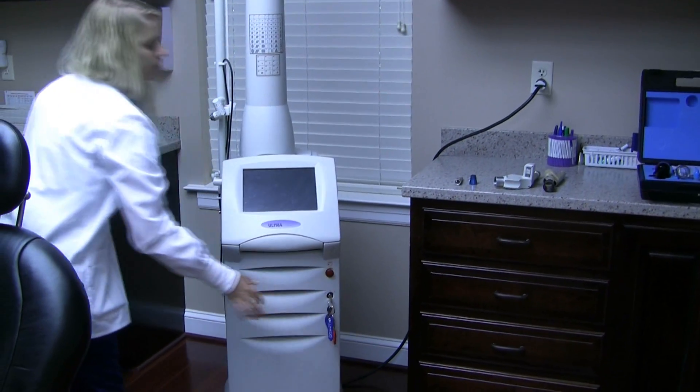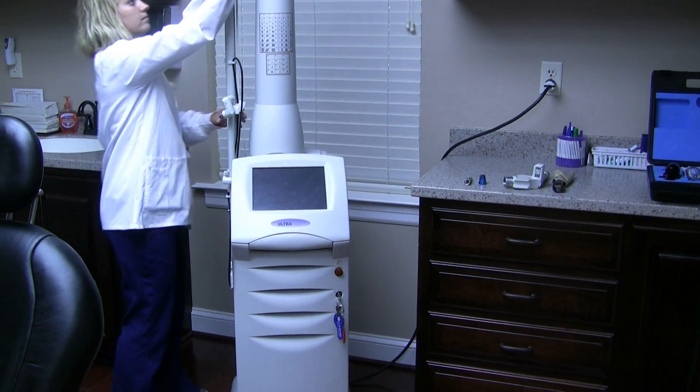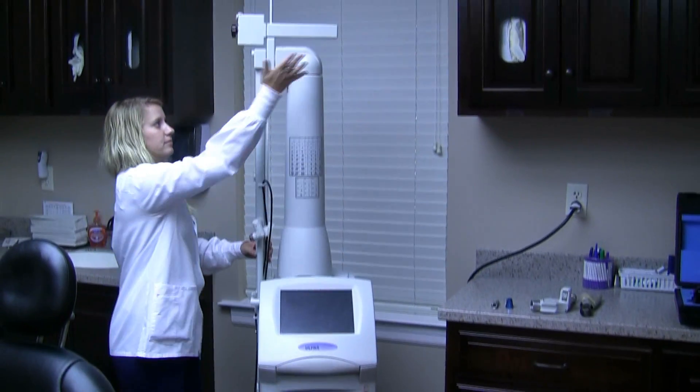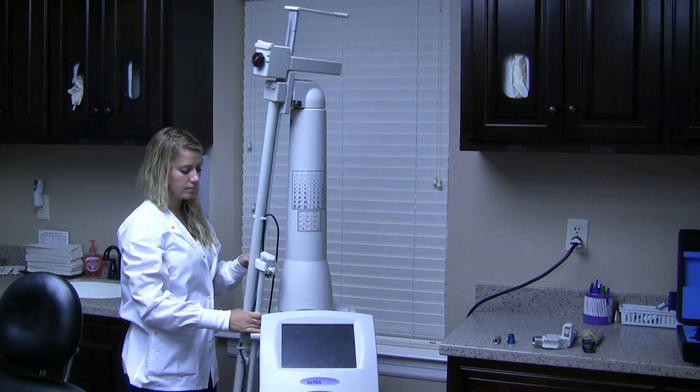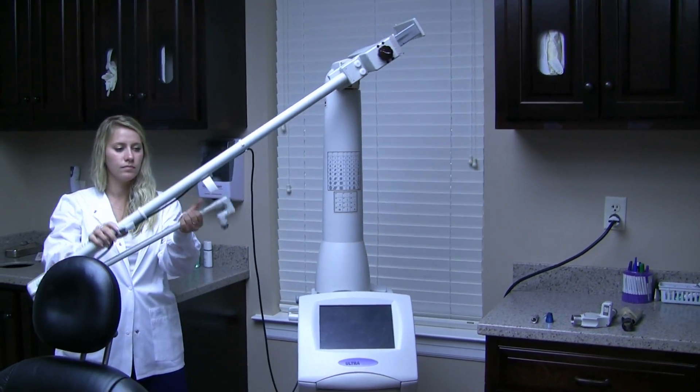How to turn on the laser: Alyssa turns it on with the key down below, then pans up. There is a little lever up top that she flips over, and then the laser just comes right out of the holster.